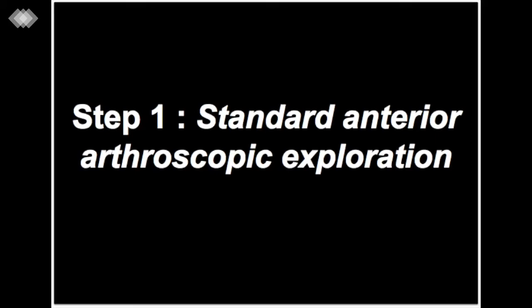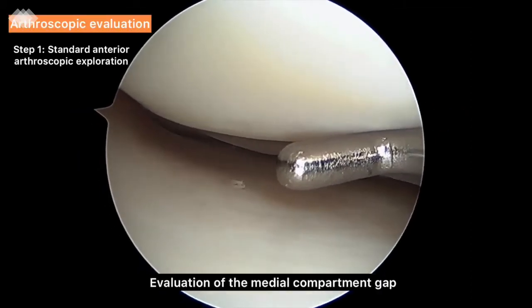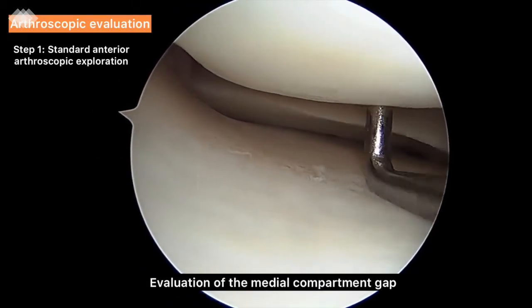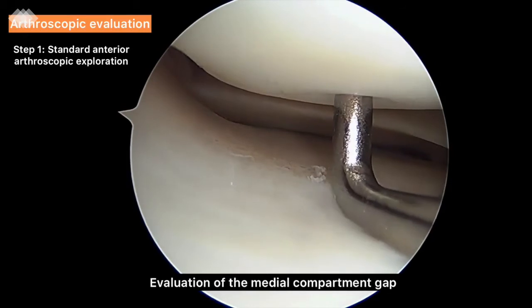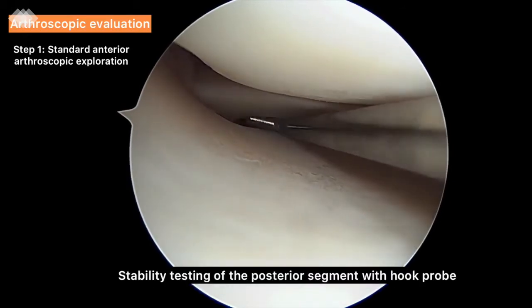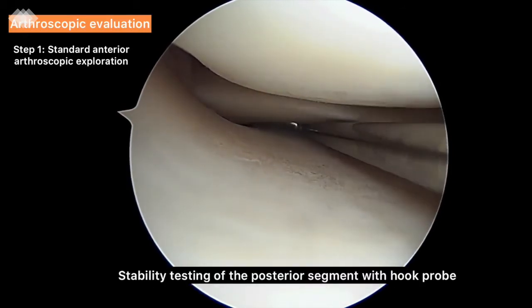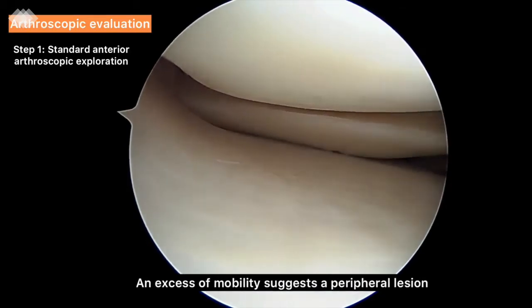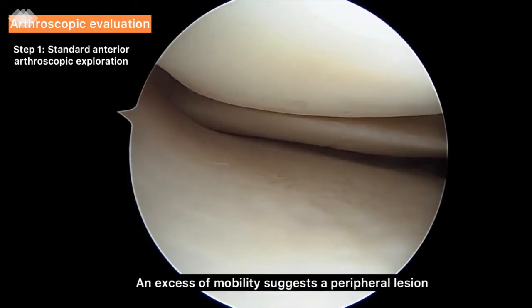In valgus position, we start to inspect the medial joint line through a standard anterolateral approach. We evaluate the compartment gap with the probe tip as reference and test the stability of the posterior segment with a hook probe. Excessive mobility suggests a peripheral lesion. Give careful attention if the inferior facet of the meniscus can be reversed when pulling on it.